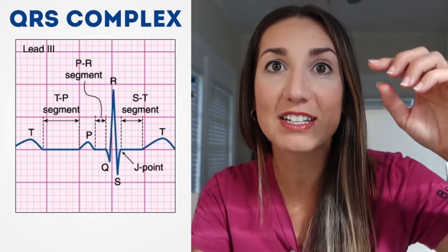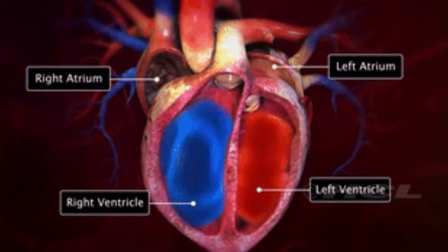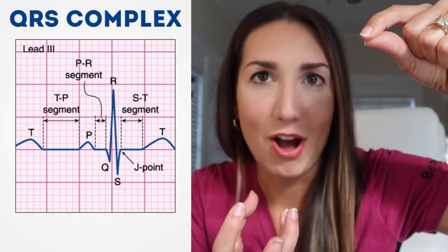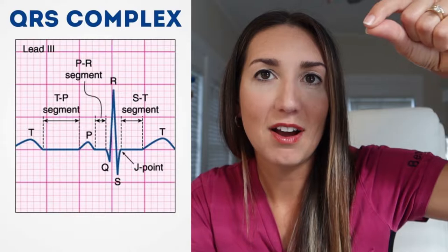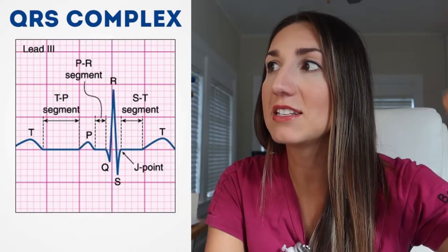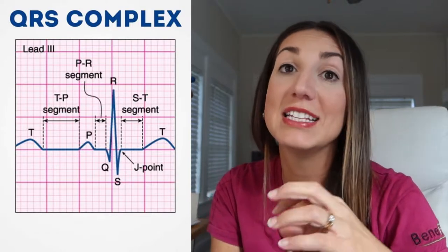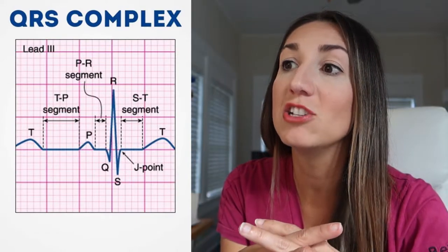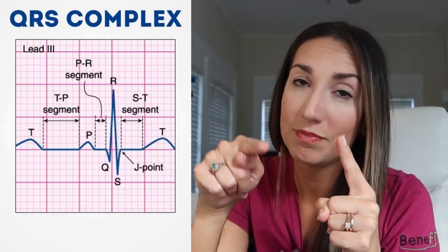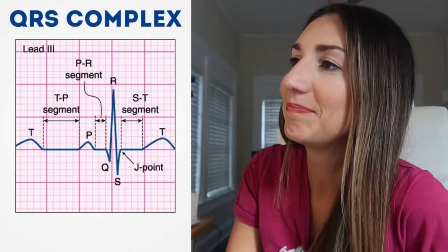But it's really the conductivity, the nodes that go from the top of the heart through the atrium and then through the ventricle. So there's a little node, or a little electrical box, let's call it, and there's one at the top of the heart, and then it goes to the middle of the heart where the ventricles start, and then it releases there. So if that duration for the electrical impulse to go from the top of the muscle to the bottom of the muscle is delayed, or if there's any issues there, then the QRS duration, or the little boop in the EKG, will be elongated, which is not great.